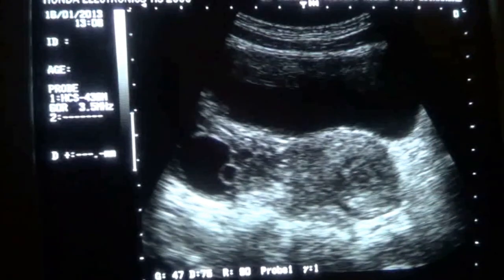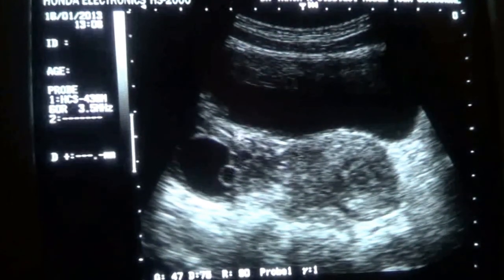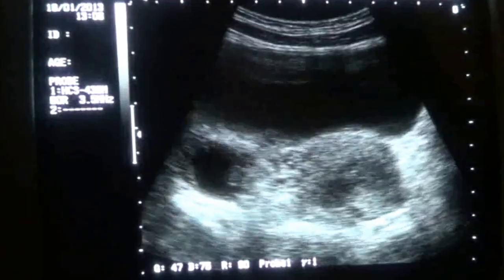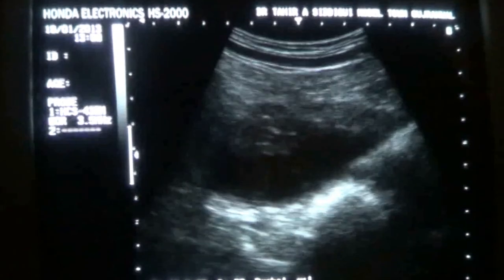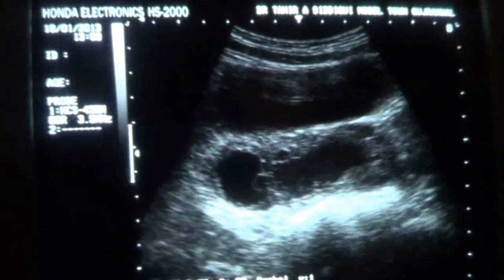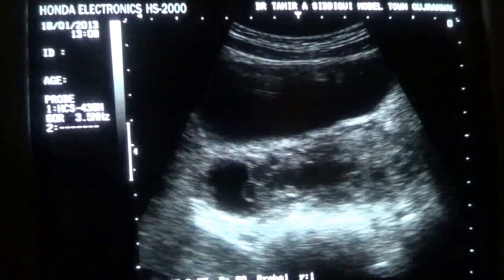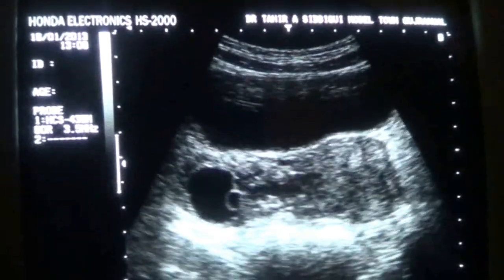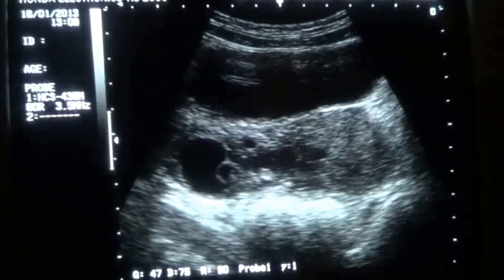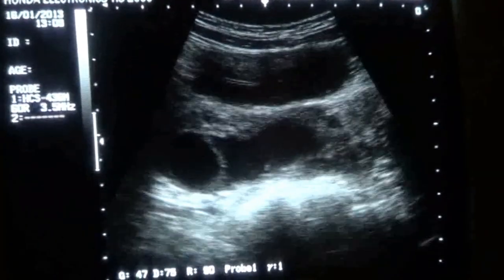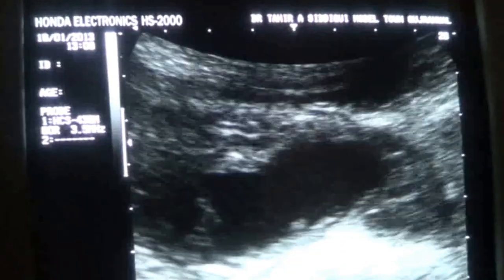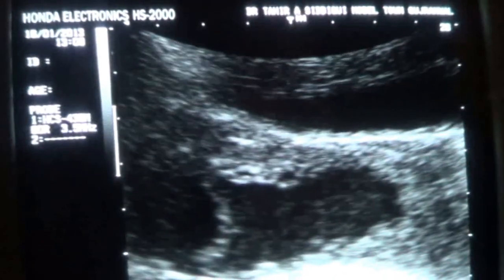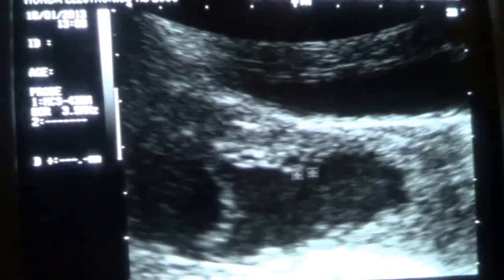This area is suggestive of a yolk sac and this is suggestive of a gestational sac. So this is a case of unruptured ectopic pregnancy — the tube has not ruptured. This is an unruptured ectopic gestational sac in the right dilated fallopian tube, which is filled with echoes representing blood. The echoes are very clearly seen within this dilated fallopian tube.